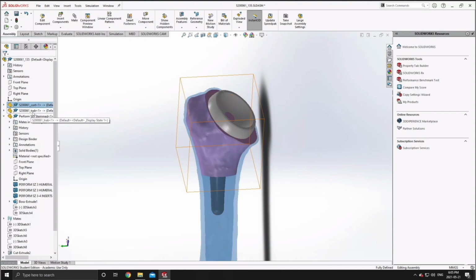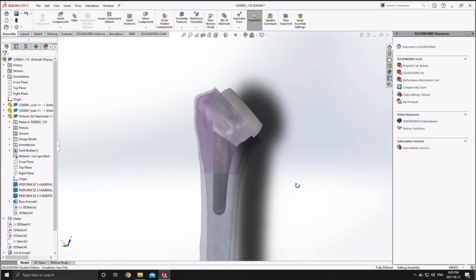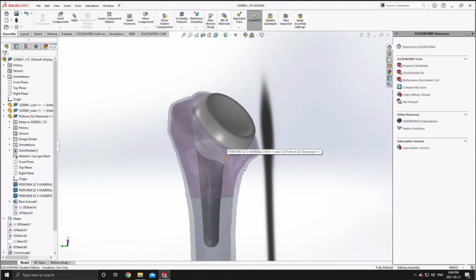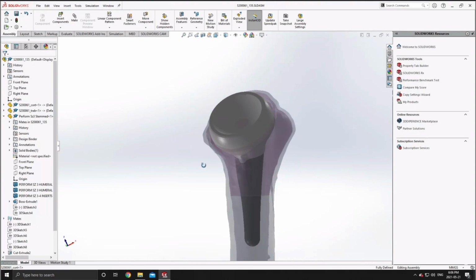Now, I guess this is a little bit of an anticlimactic end to our implant positioning, but as you can see here, our implant is now fully positioned in the trabecular and cortical bone, and that trabecular bone has been shortened to 40 millimeters, as well as the cortical bone has been shortened to 180 millimeters distal to the central axis, or I guess the center point of the humeral head.